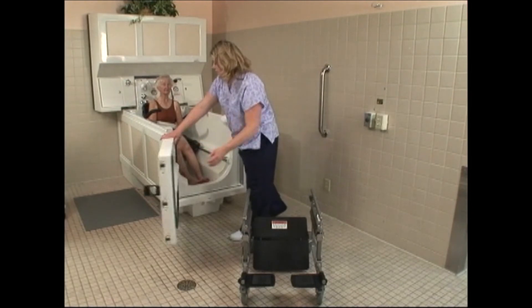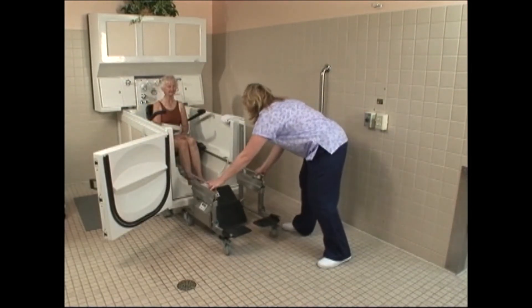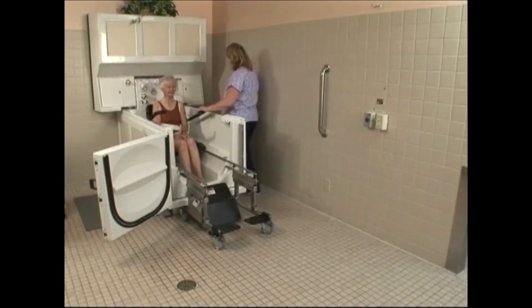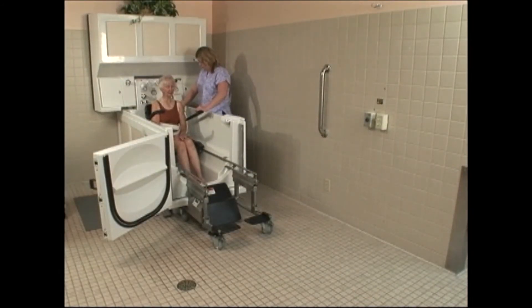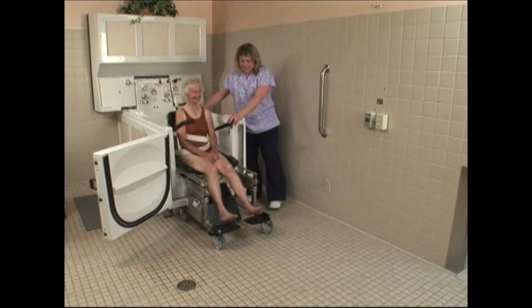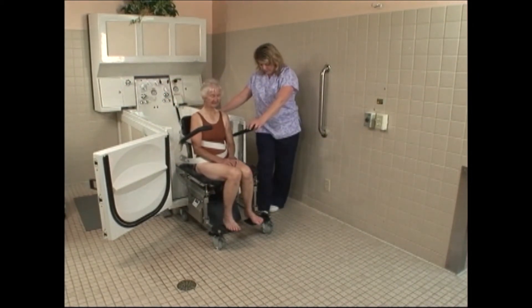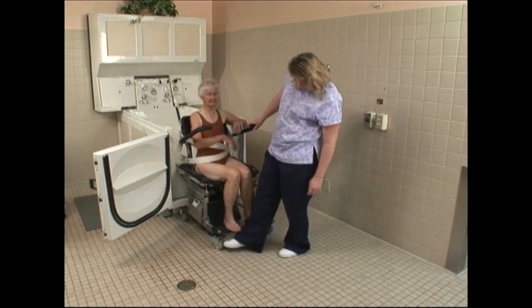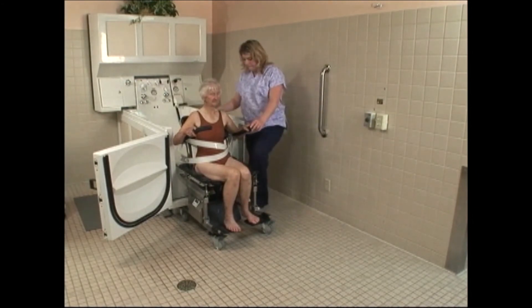With the water completely drained, open the door and reconnect the carrier base to the tub and lock the wheels. Unlatch the chair from the tub and slide the resident back out onto the level glide base. Make sure the chair is completely engaged with the base, unlock the wheels, and step down on the lever to release the carrier from the tub.